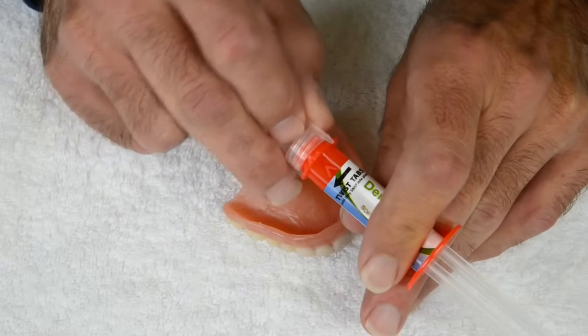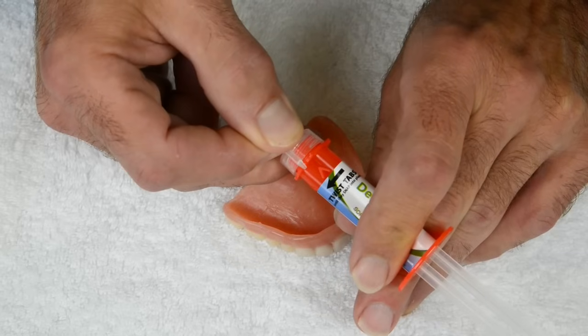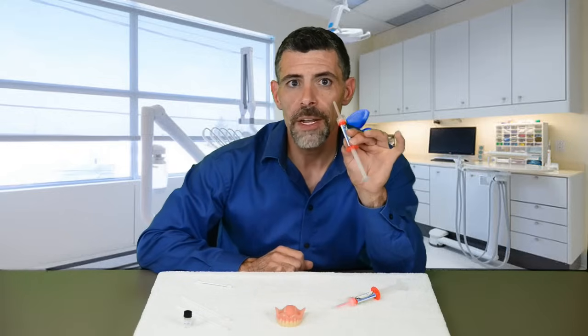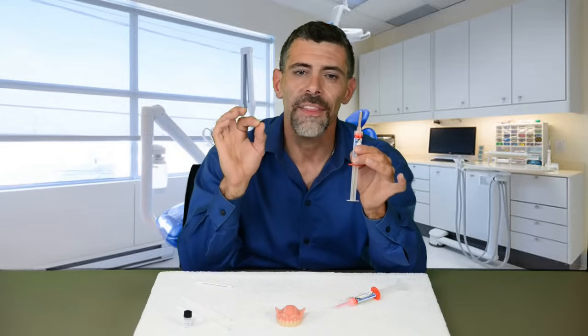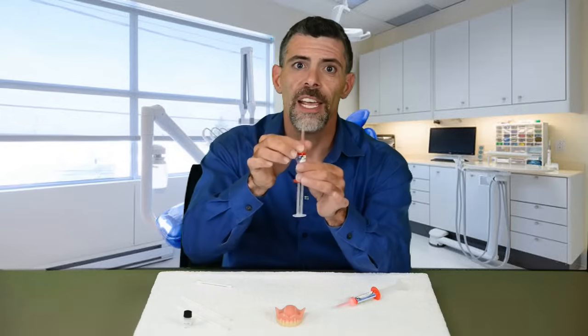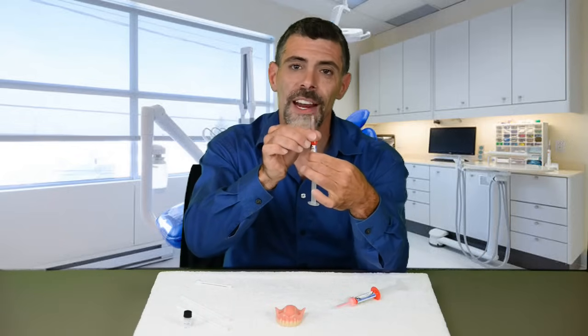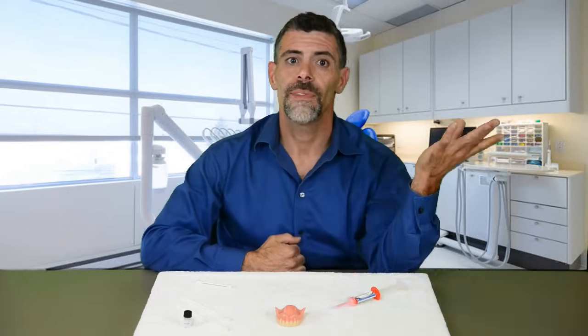That black arrow on the label tells you which way to turn the clear applicator tip. It is very important to twist the clear applicator tip in the direction indicated — not the applicator body. If you twist the body, silicone will squish out the sides and your Denture Fit is now useless.